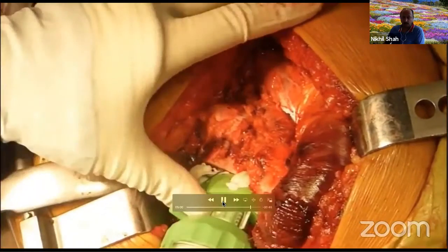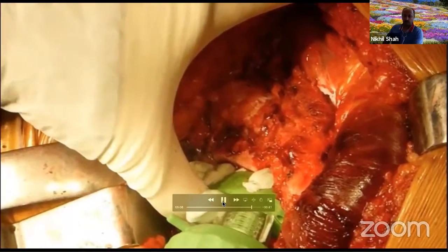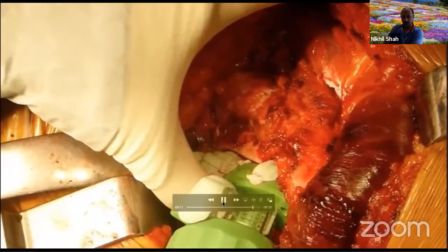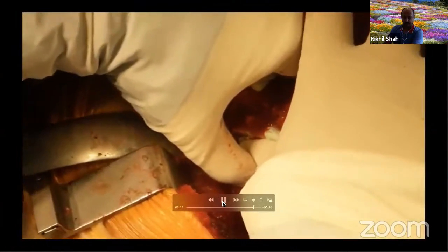Sustained pressure is important. So you can see that blood and fat coming out under pressure from the rest of the exposed neck, and that signifies that you've got really good pressurization. So cement will really penetrate into the cancellous bone, giving you a nice interface.